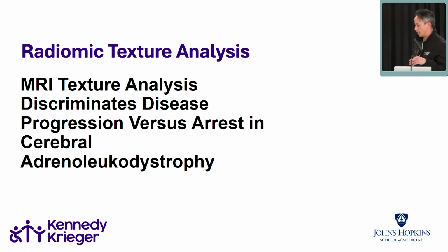And what a texture analysis does is, you can look at gray matter, white matter. We're interested in white matter, of course, at least at first glance. In the same way, if you do a biopsy of a tumor, for example, and you put it on a slide and you look at the slide, you can look for features of those cells that make you think, well, this is a benign tumor versus this is an invasive tumor, or something somewhere in the middle. And so I want to liken it to that.